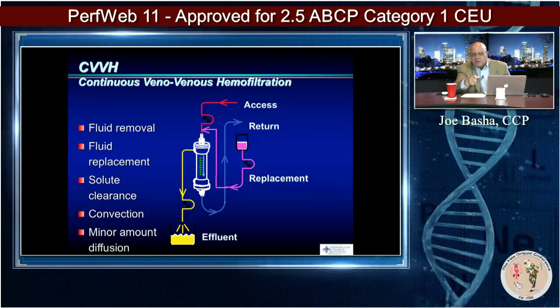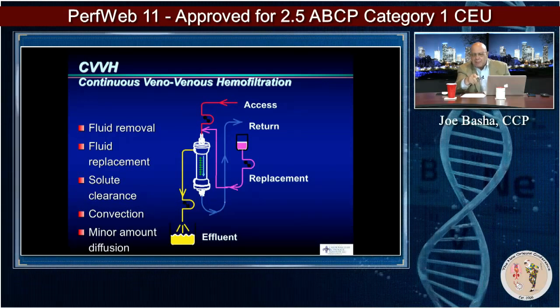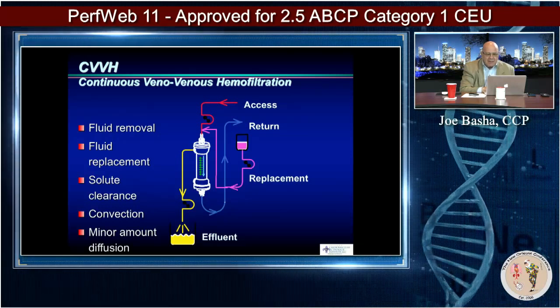And then you see the replacement. And the replacement in the magenta can be pre, but it can also be post down here. And then you have the effluent.